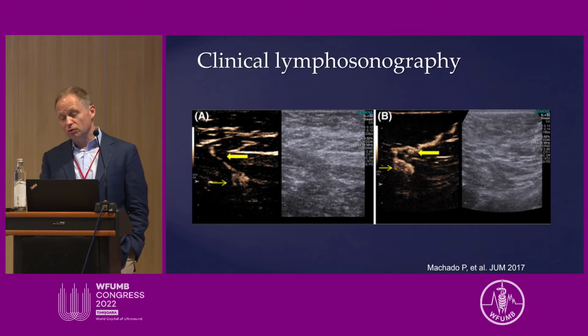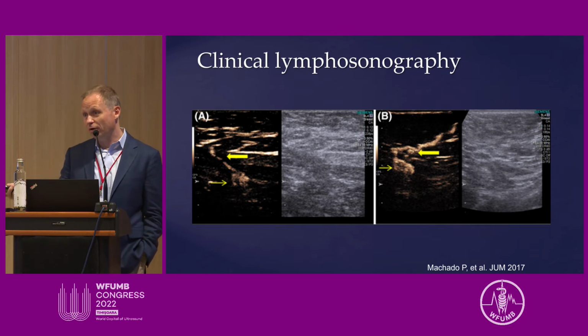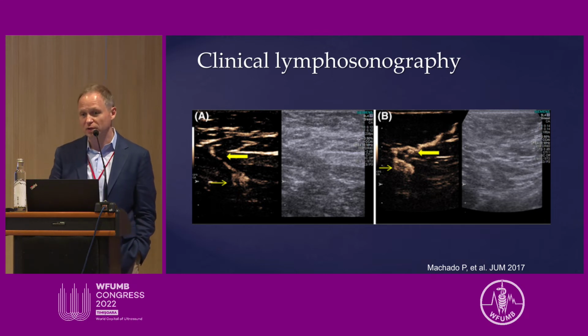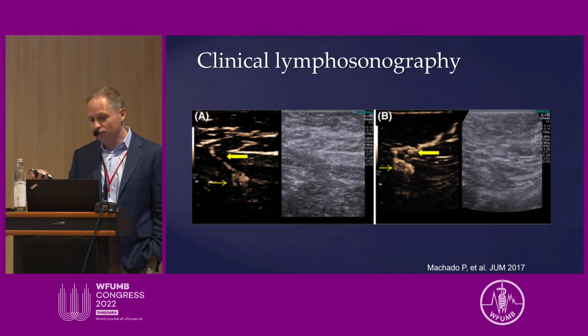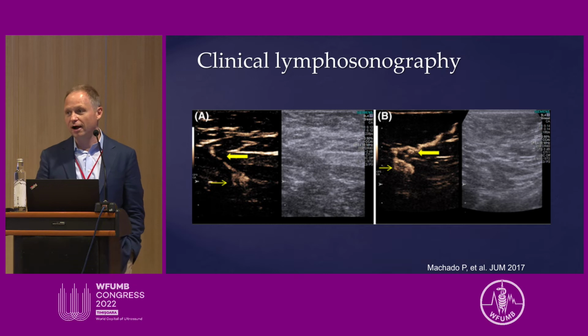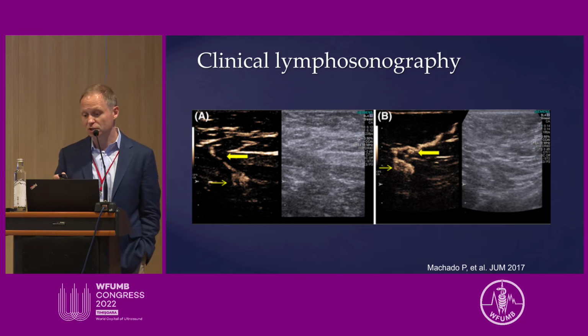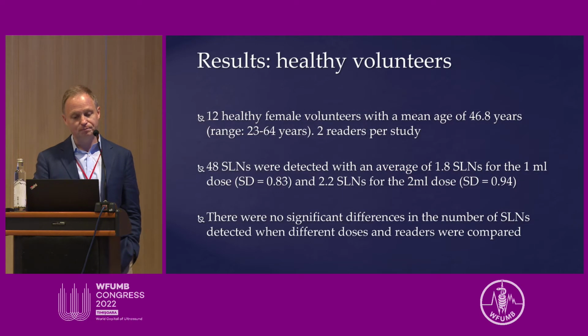Also, we've seen quite a few lymph nodes with fatty hilum that on pathology become pathological or metastatic, because lots of those lymph nodes will have metastatic deposit along the cortex, and the hilum will actually be preserved. So again, another thing that is out of the window in my mind: I don't use fatty hilum as a sign of benign lymph node, because we've seen a ton of metastatic lymph nodes with preserved fatty hilum, especially when they're small and at the early stages of metastatic involvement.